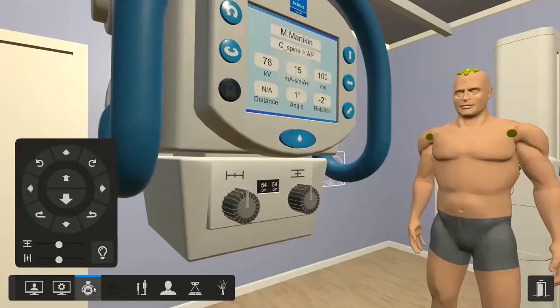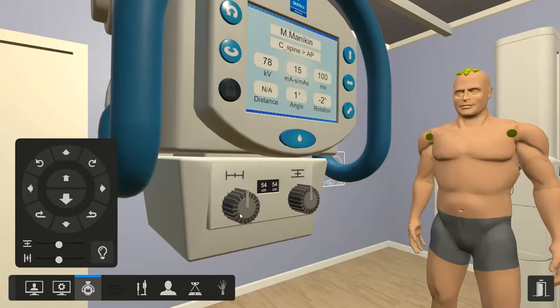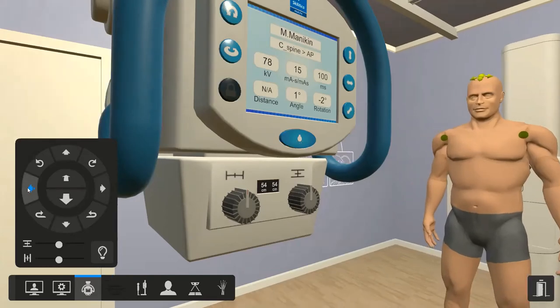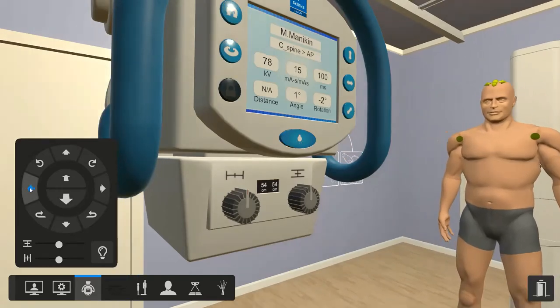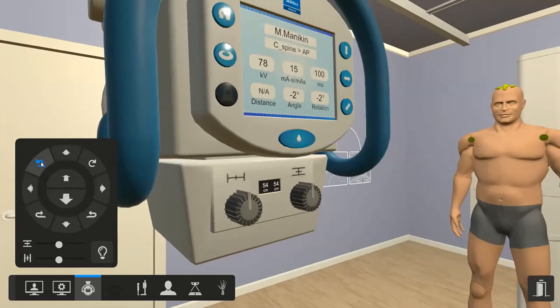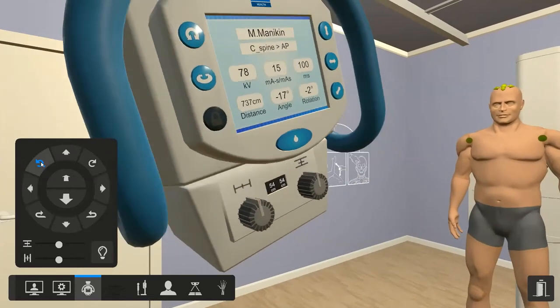The next screen takes you immediately into the tube view. If you've used the virtual reality version, you'd know that you'd walk over to the tube and press these buttons and turn these dials. But of course we're not in virtual reality today, so we're just going to control the tube using the icon.